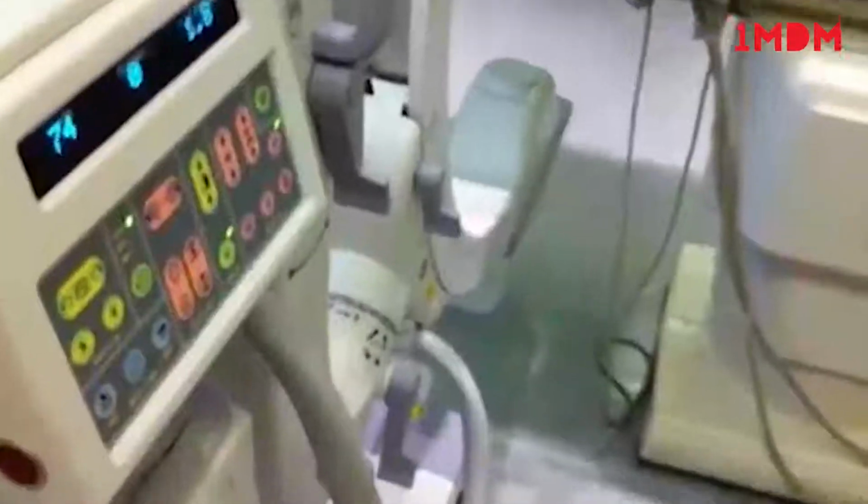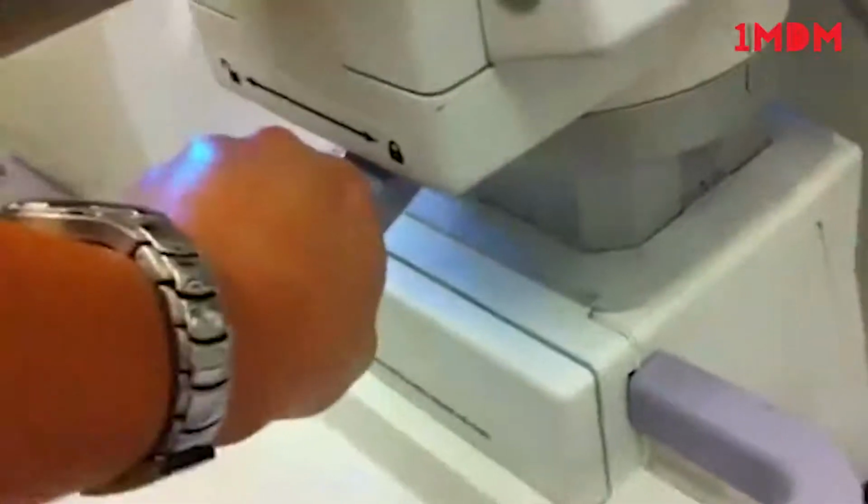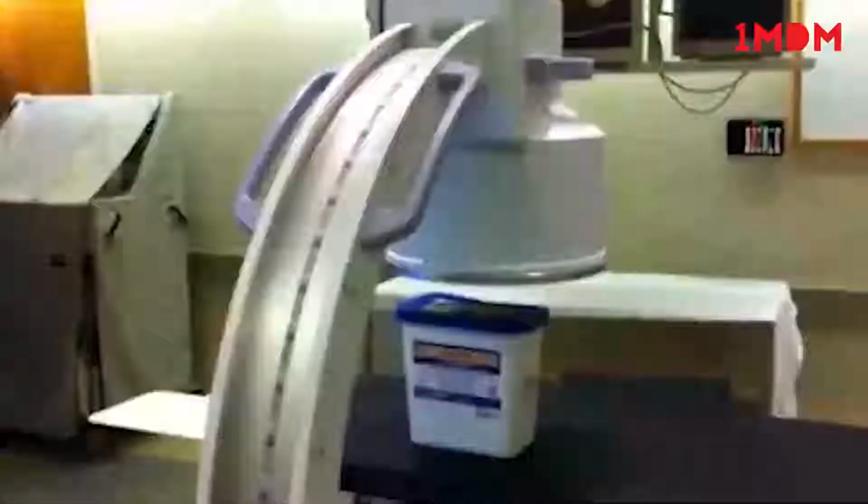The other controls here that are not as big, but are equally as important, is wig-wag. So you can, oh, this is a tight one. I usually just have to pound it a little bit. There we go. You see here? You can wigwag the machine. That means you could kind of wigwag it, kind of like a dog's tail, like that.